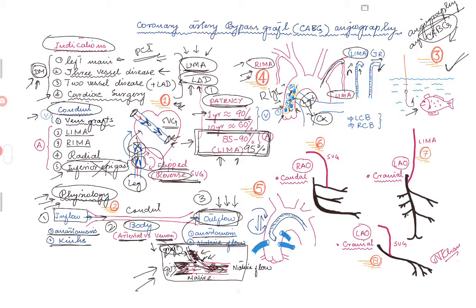One thing in all the books on intervention as well as diagnostic catheterization guidelines is to have respect for the LIMA. When I say have respect for the LIMA, it is because the ostium of the LIMA is very, very fragile. I know we do it all the time, we do diagnostic angiograms as well as interventions, but in all the textbooks, all the experts say to have very great respect for the LIMA or the anastomosis. Don't manipulate too much, because this artery can dissect very easily.